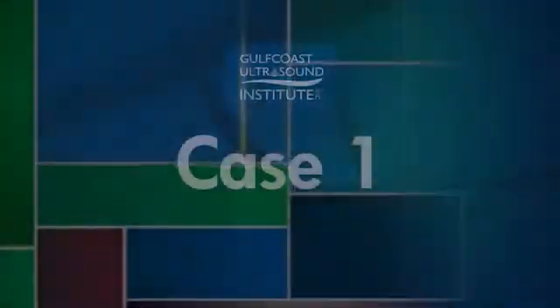So welcome. Good evening. Well, OB cases, we're going to go over a variety of different things. OB cases can be kind of challenging because you're looking at a patient within a patient. So we're not expecting you to know all of the abnormalities that I'm presenting, but just in case you run across it in your lab, that you know where else to look, what else should I do? What can I do to help try to find out what this abnormality is? So let's go ahead and get started.